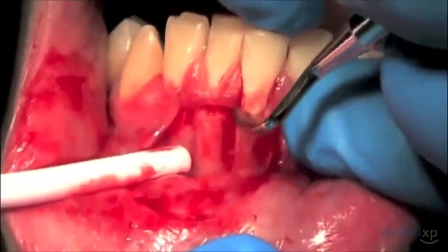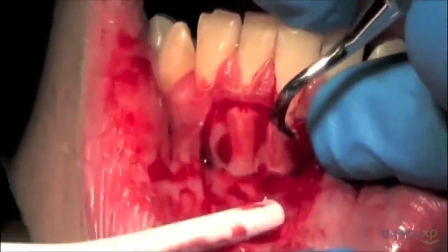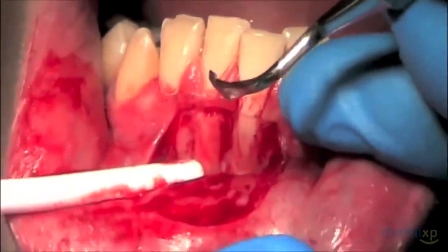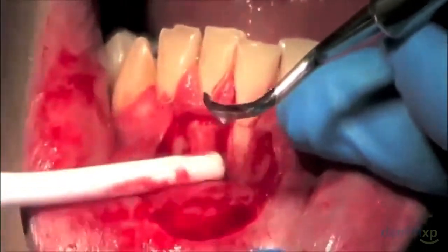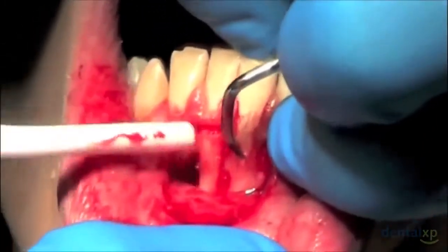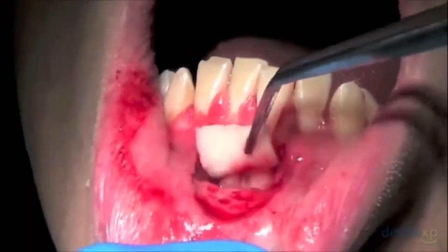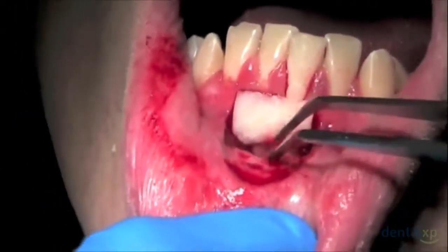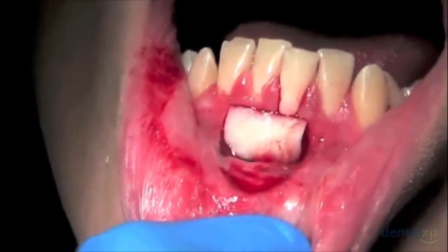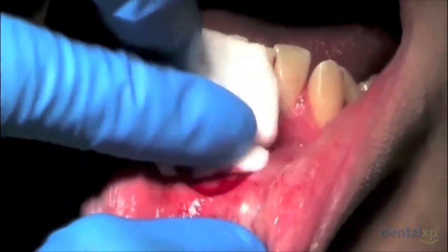At this point, using a number 12 Rhodes back action chisel, we're simply scaling and root planing the root surface to finish up preparation of the recipient bed. All I'm trying to do here is remove any remaining calculus or soft cementum that may be present. As far as etching the root surface, this can be performed with things such as a tetracycline slurry, citric acid, EDTA, among other agents. However, the key point here is to make sure that the root surface is clean. It also does not need to be a concave root surface, just simply needs to be debrided properly.